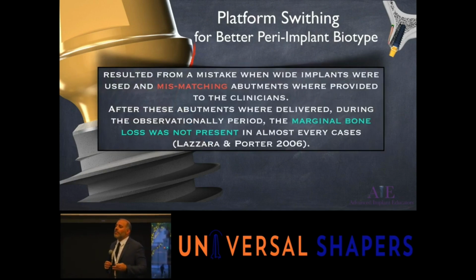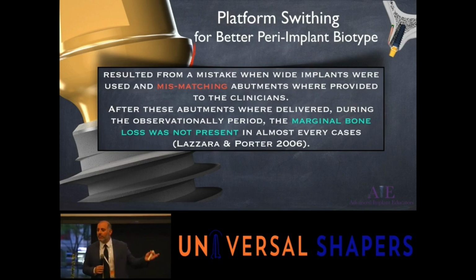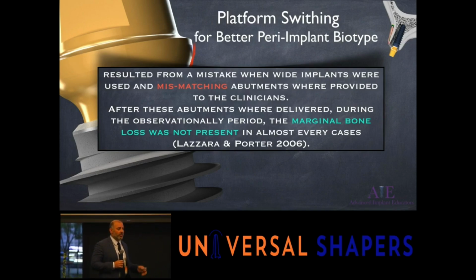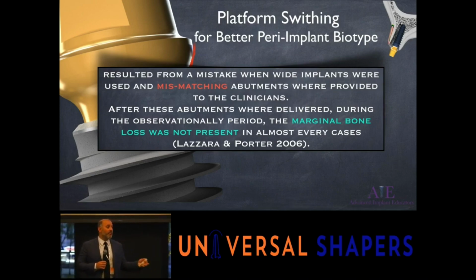And what they did was they mismatched the abutments. So for those of you who know how to use, let's say, the Zimmer system, that's a very popular system, the internal hex. They have the green, the purple, and the gold. Well, they just mismatched the green and the purple. They fit. And today we do this all the time. We call that platform switching.